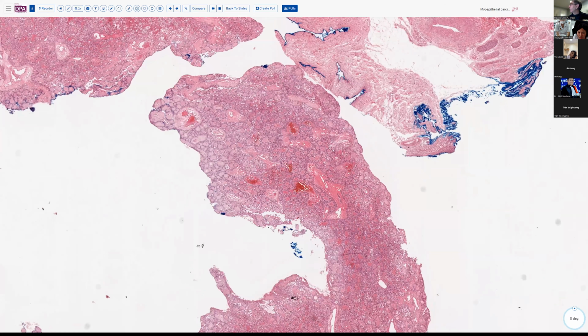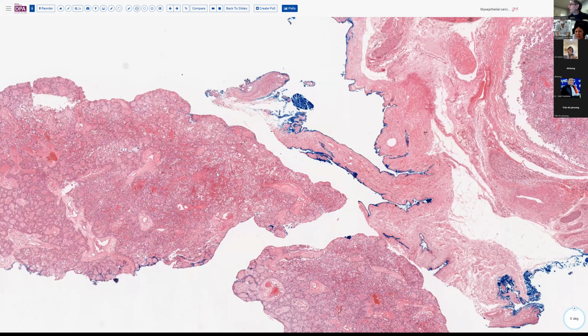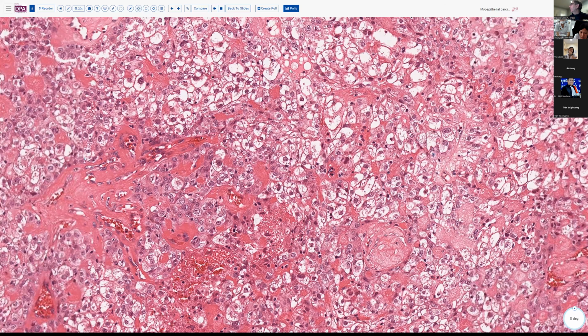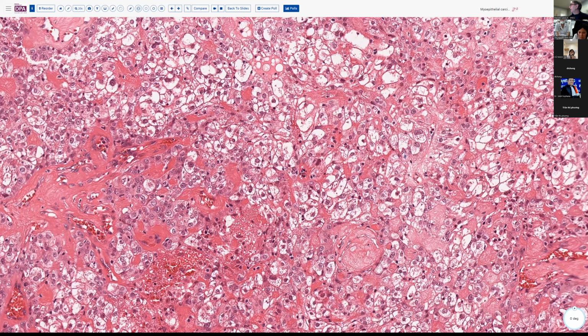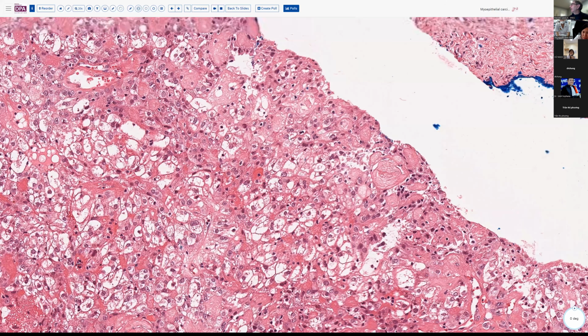We'll look again for some areas of necrosis. So here you can see again the higher nuclear grade. There are a few mitoses. Here's one. Here's another one. A few more around in this area. And we do have a few small areas of microscopic necrosis here. It's not macroscopic, but there is a little bit of necrotic debris in a few areas here as well.